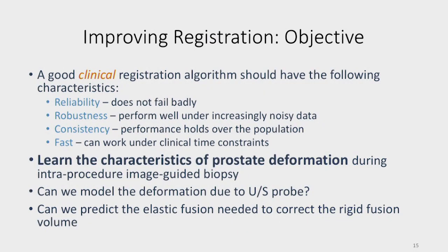Okay, so 17 years ago, I introduced a program utilizing real-time segmentation for brachytherapy. And we published after that a paper on deflection and deformation, the majority of which happened with needle insertion. So it wasn't the setup and the template registration, it was actually the needles pushing the prostate and deforming it. So how do you compensate for that? Or can you come up with a mechanism to compensate for that during the procedure? So that'd be interesting.